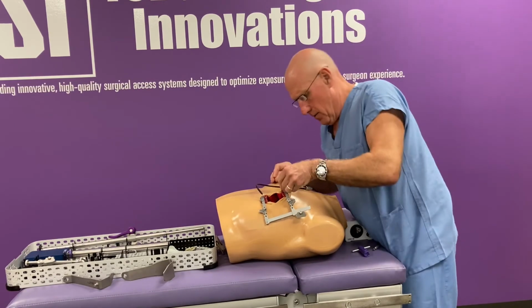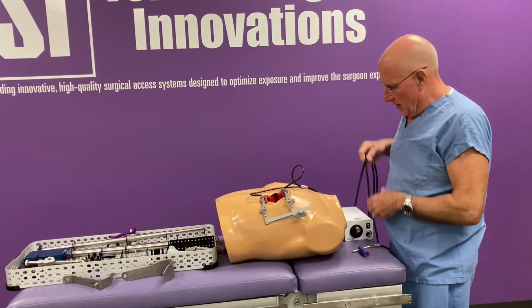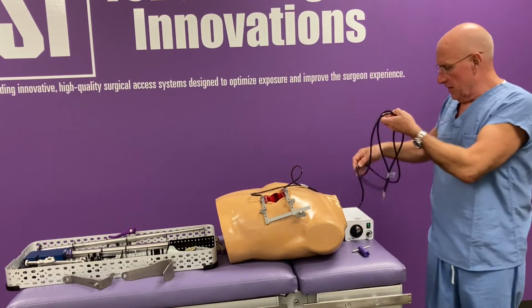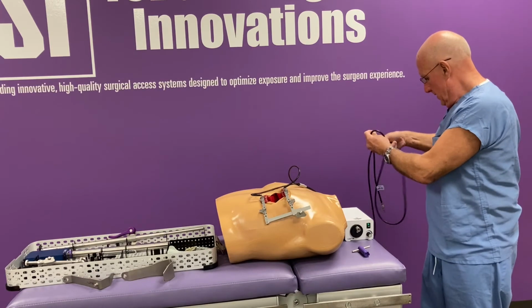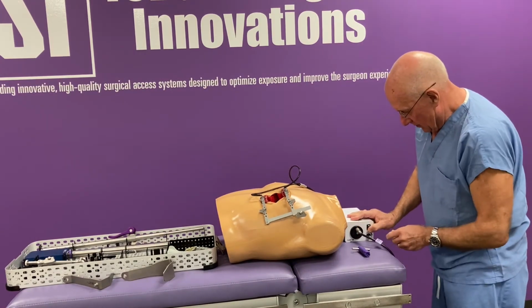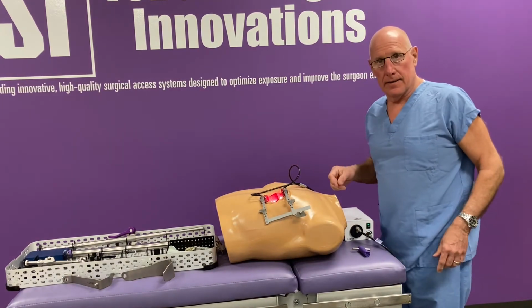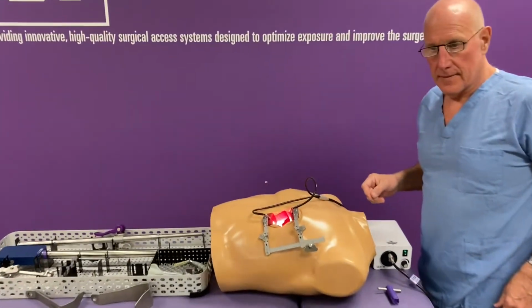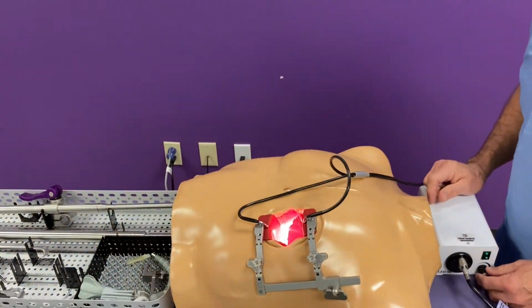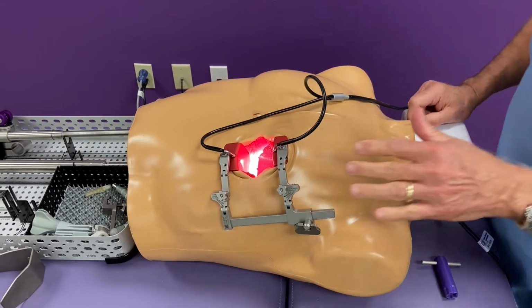Okay, right into these little light channels right here. And then we're going to go ahead and pass this light cable off the sterile field, where it'll be put into the light source. Light source is turned on. Now we have lighting in there. You can see. Again, I always like to say this is what we have without the light, this is what we have with it. So now we can see good.